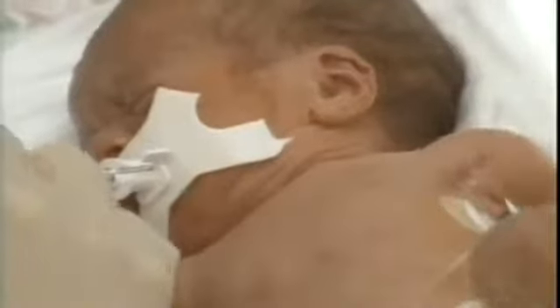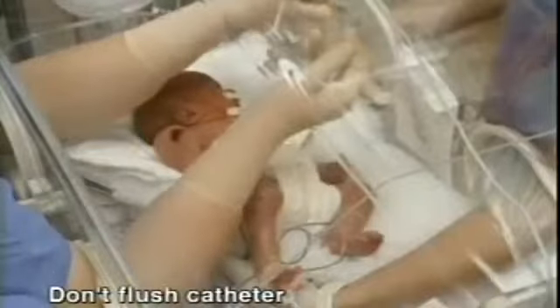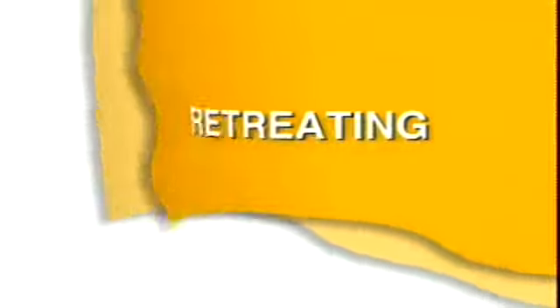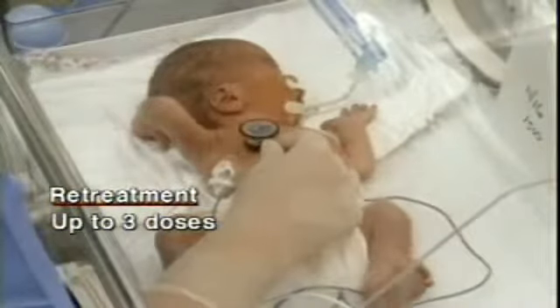Then, repeat the process for each of the remaining 3 fractional doses. Reposition the infant before each aliquot. When the final aliquot has been given, remove the catheter without flushing it and ventilate. If respiratory distress continues, up to 3 subsequent doses may be administered. Retreatment should occur only if the infant has RDS, remains intubated, and requires at least 30% inspired oxygen to maintain an arterial oxygenation of less than or equal to 80 torr.